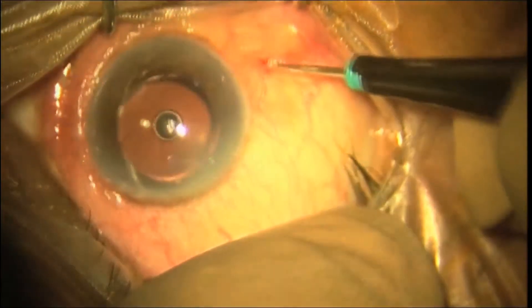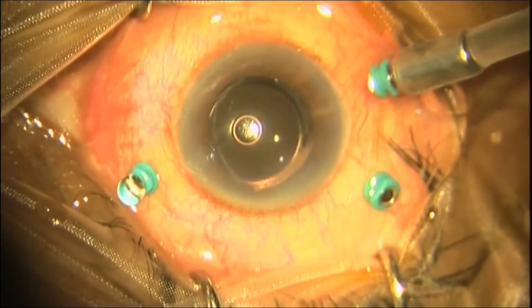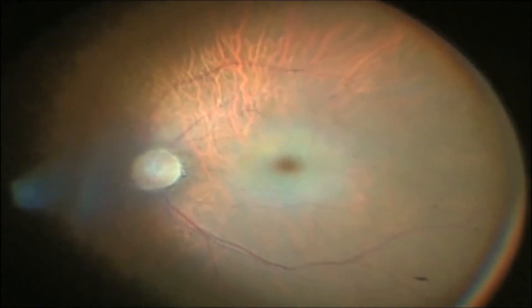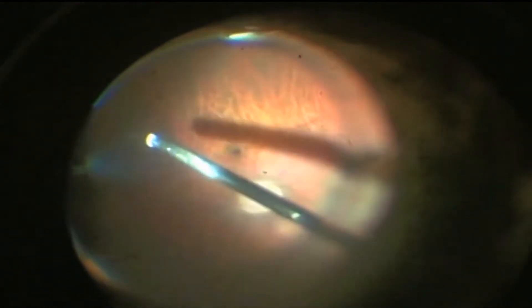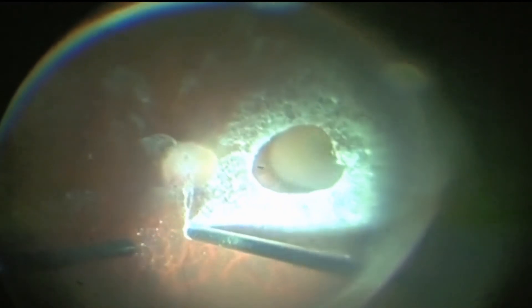Based on this experience, we decided to do a 25-gauge, 3-port, pars plana vitrectomy. A low IOP vitrectomy was performed with the IOP set at 8 mmHg. The thickened sheath and the occluded central retinal artery could be visualized. A posterior vitreous detachment was induced very carefully, since the globe can collapse easily due to the low IOP.